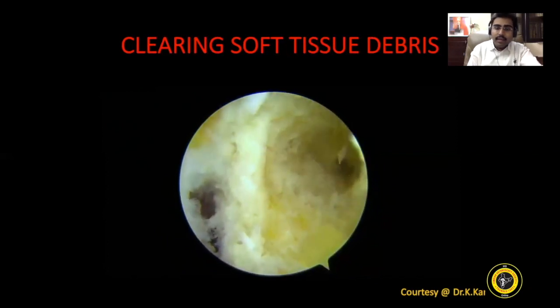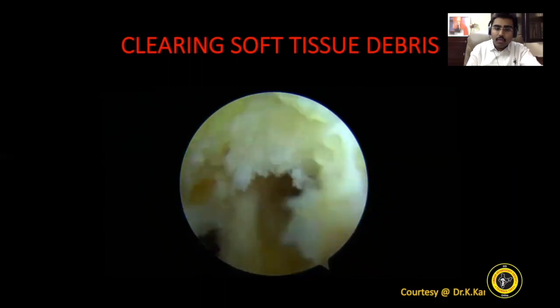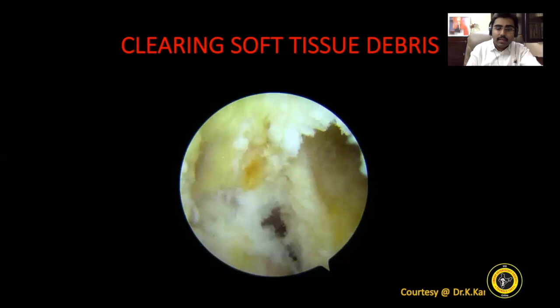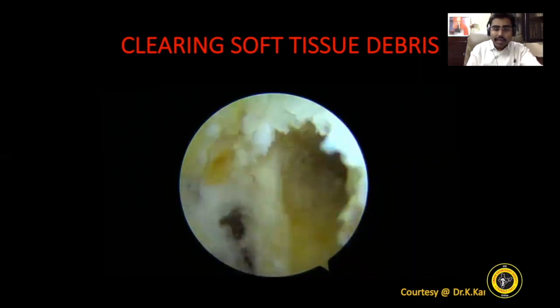Yes, this is the tunnel within the tunnel, the inner tunnel being 4.5 and the outer being a 9.5 mm tunnel. You can see those oily droplets there, which are potential growth stimulants.